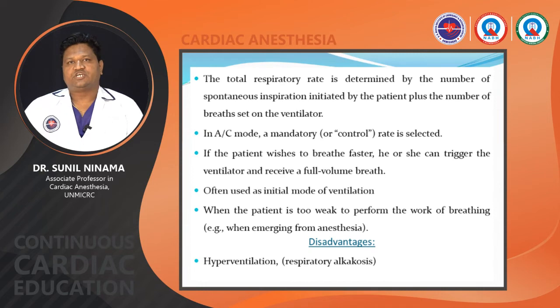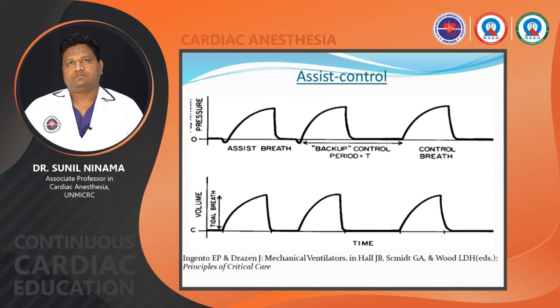It is often used as an initial mode of ventilation, and when the patient is too weak to perform the work of breathing, or when emerging from anesthesia. Disadvantages are hyperventilation. This is the assist control. You can see in the figure, these are the mechanical breaths, and this is a negative inflection which shows the patient trying to breathe. In assist control mode, they assist the total mechanical breath to the patient.